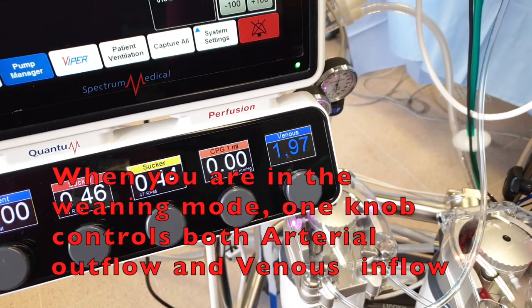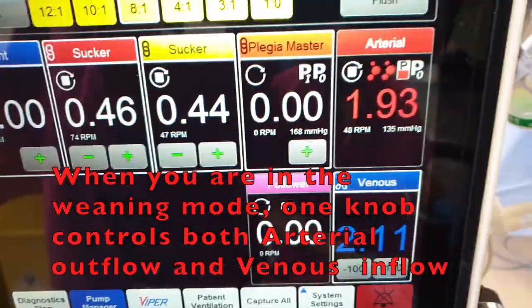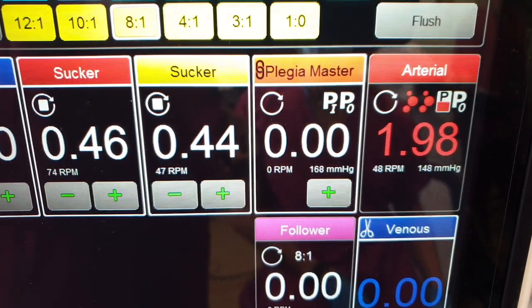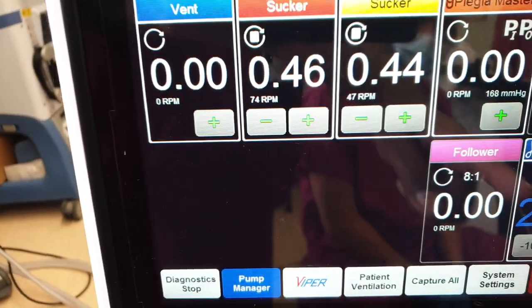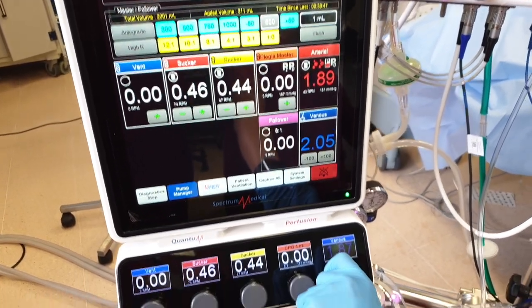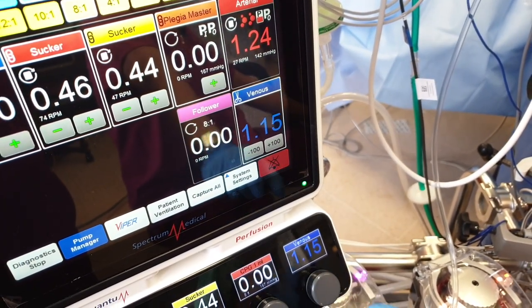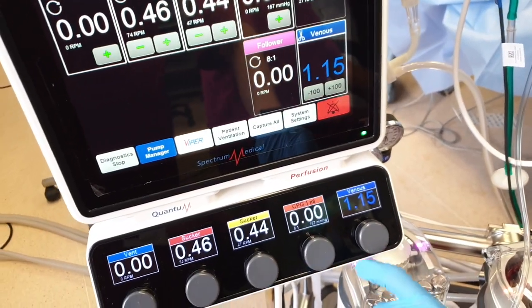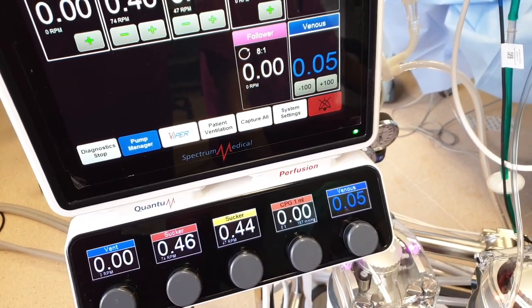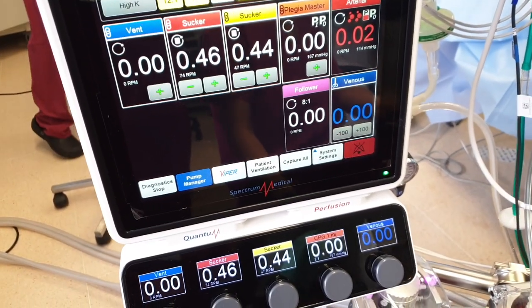Hold flow there. If you want to add volume, just press 100 and you will add 100. Easy. So coming down. Quarter flow. Happy? Coming off. Thank you. That's off bypass. Thanks.